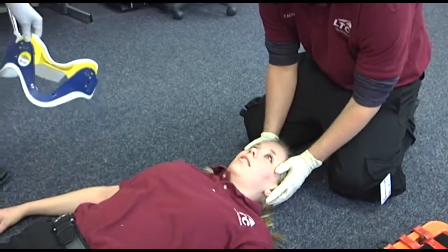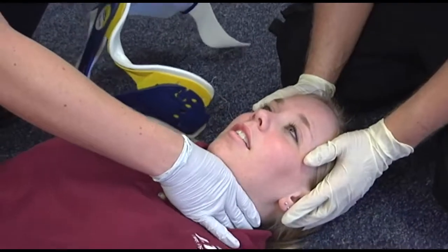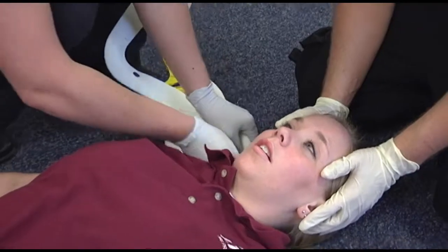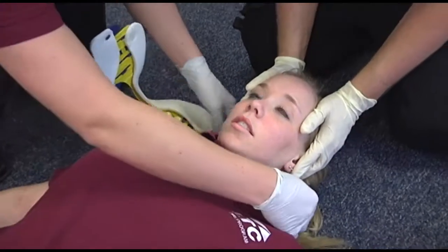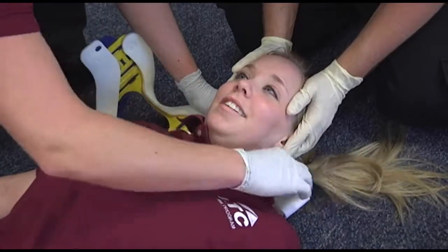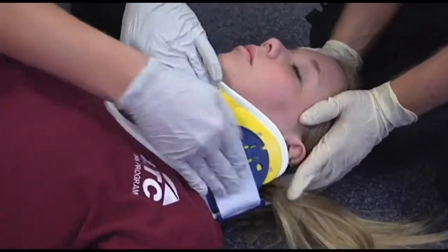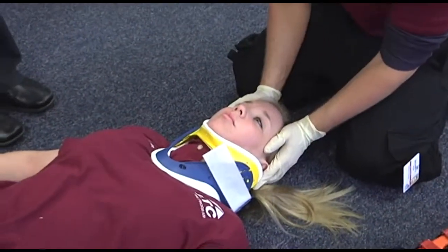C-collar — you're going to check the sizing of the C-collar and apply it.